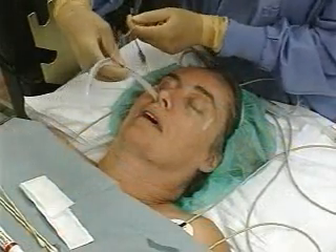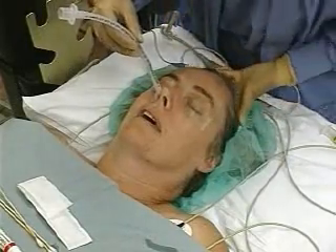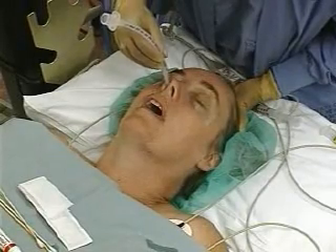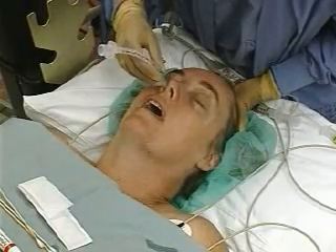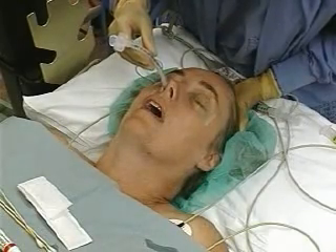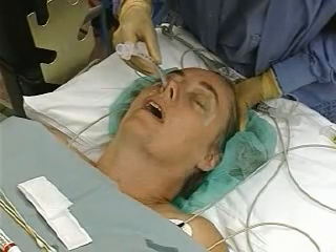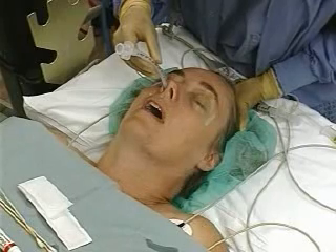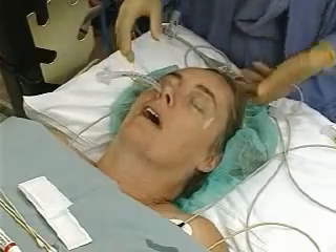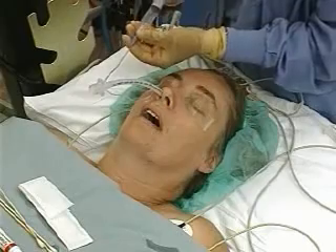Place the tube gently in the nose and advance it using the technique described for the nasal airway. Gently extend the neck if the tube is difficult to pass. Watch for signs of fogging or condensation in the tube; as the tube approaches the vocal cords, the quality of the voice may also change. Ask the patient to breathe deeply and gently advance the tube through the cords while they are open during inspiration. The patient should immediately lose phonation. Inflate the cuff, verify position, and secure as for an oral endotracheal tube.